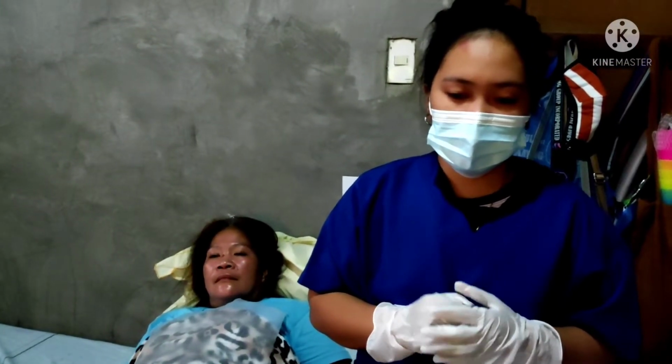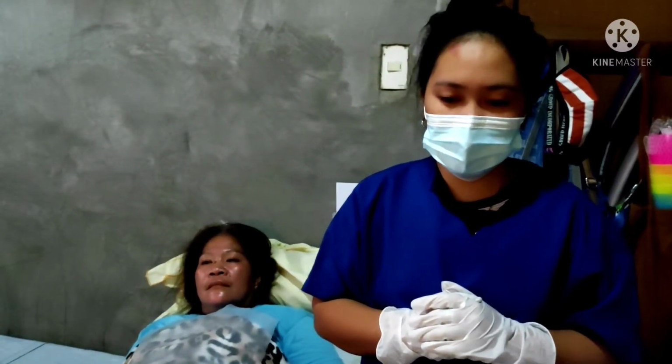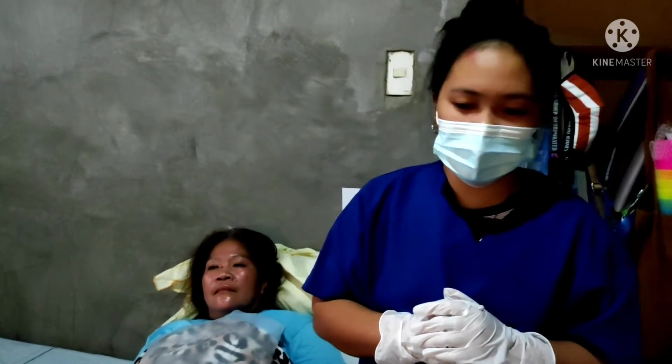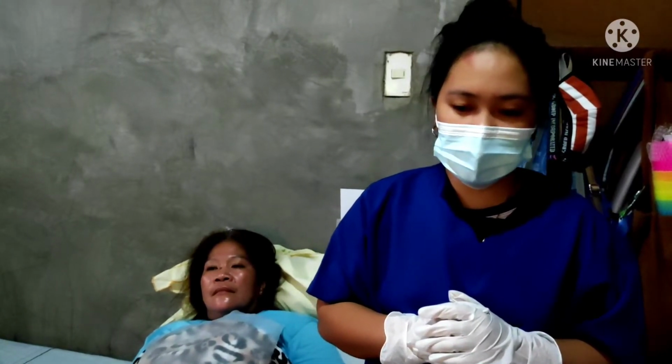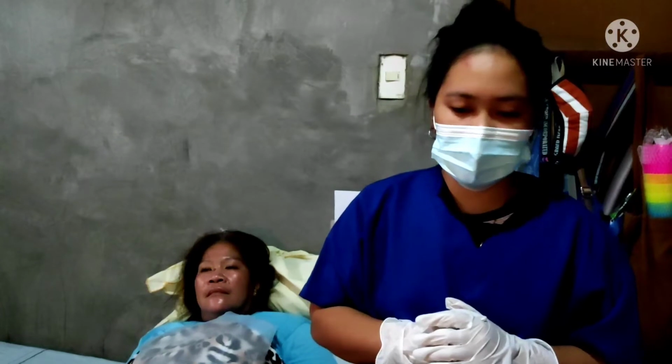If you're performing nasotracheal suctioning, insert the catheter about 20 cm, or 8 inches, in adults. Older children, 16 to 20 cm, or 6 to 8 inches. Infants and younger children, 8 to 14 cm, or 3 to 5.5 inches.